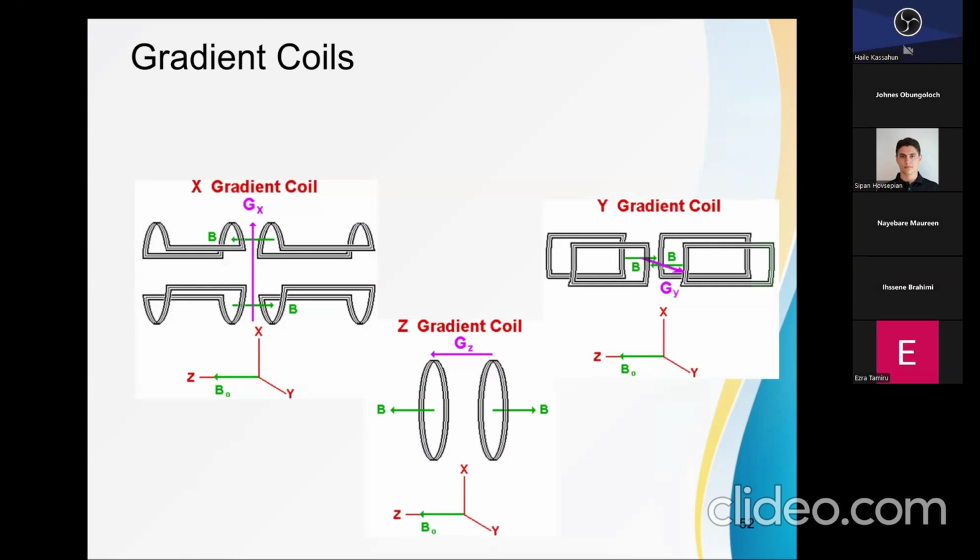Normally the Z direction is the direction along the bore of the magnet, so you can use anti-Helmholtz coils that provide the magnetic field along the Z direction. But XY gradient coils also have to provide magnetic fields in the X and Y directions, and therefore their configuration is relatively different from what you'd have for a Z magnet.